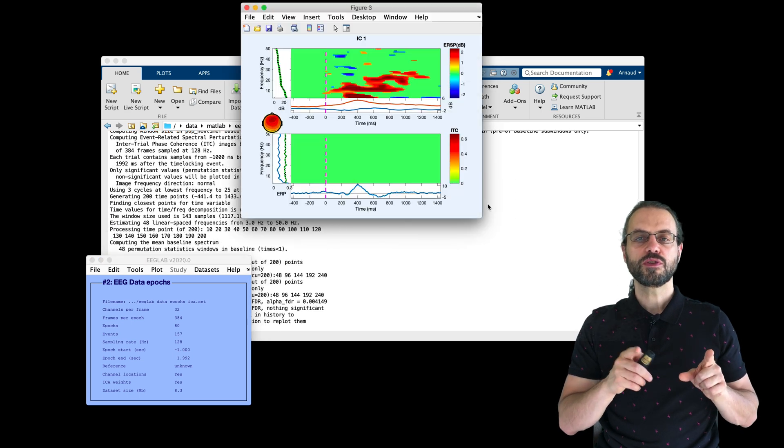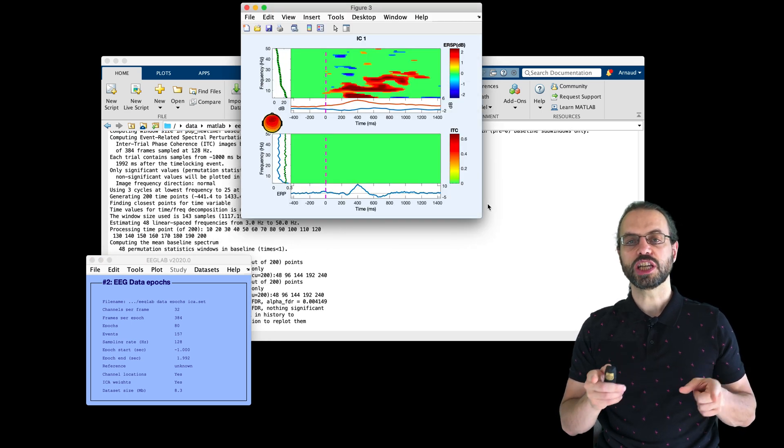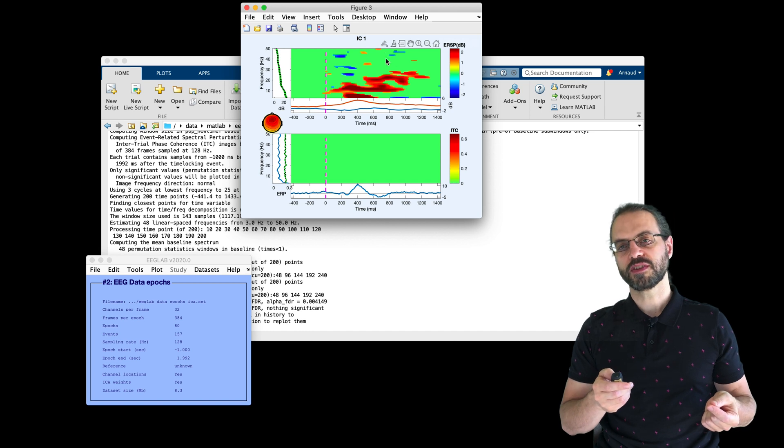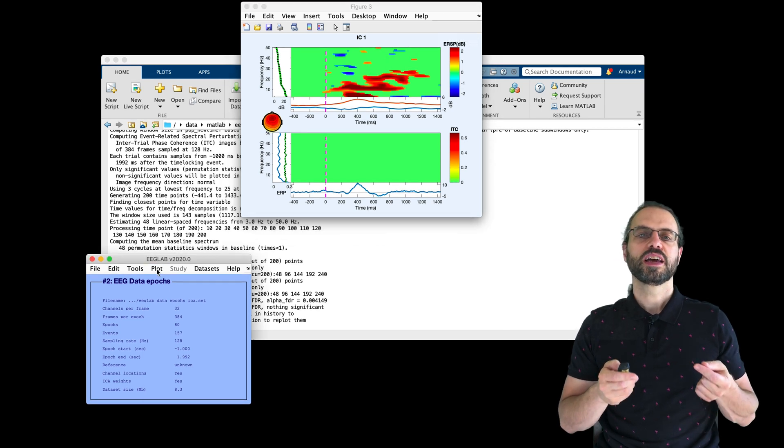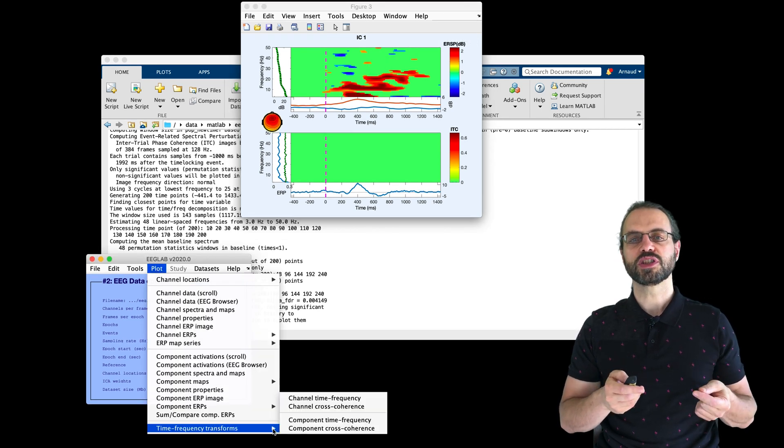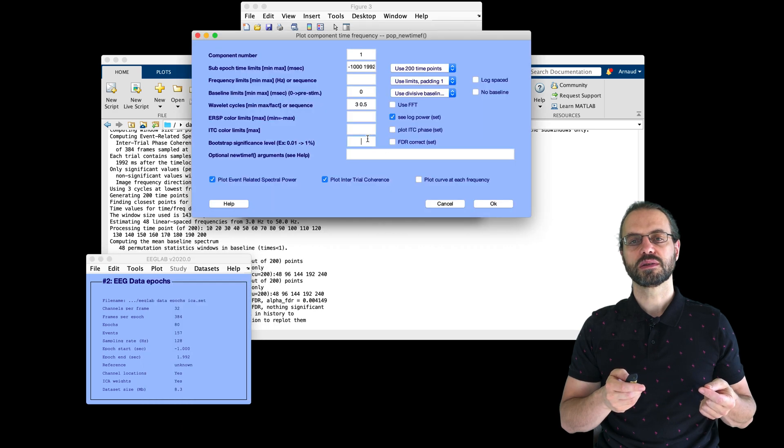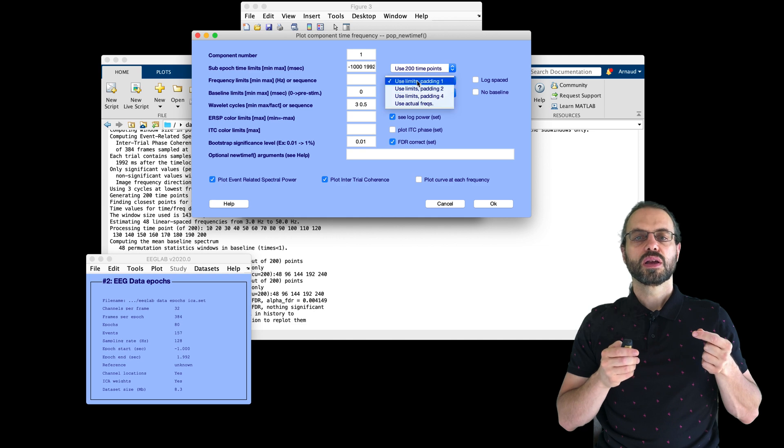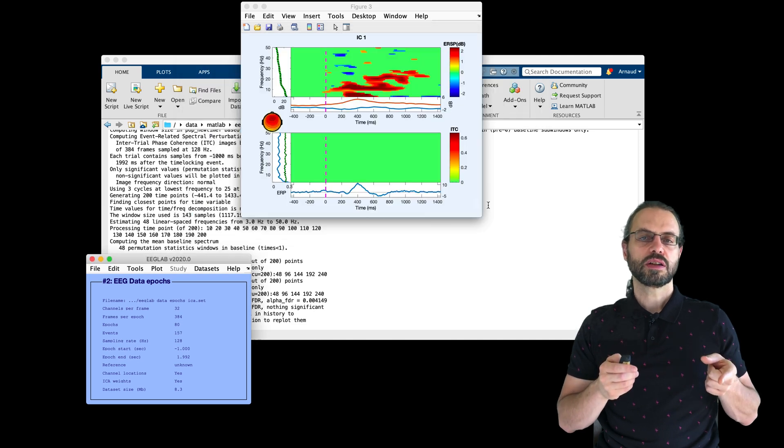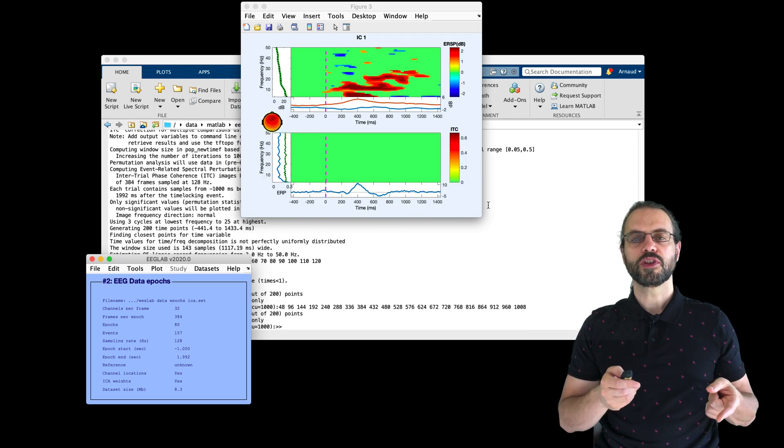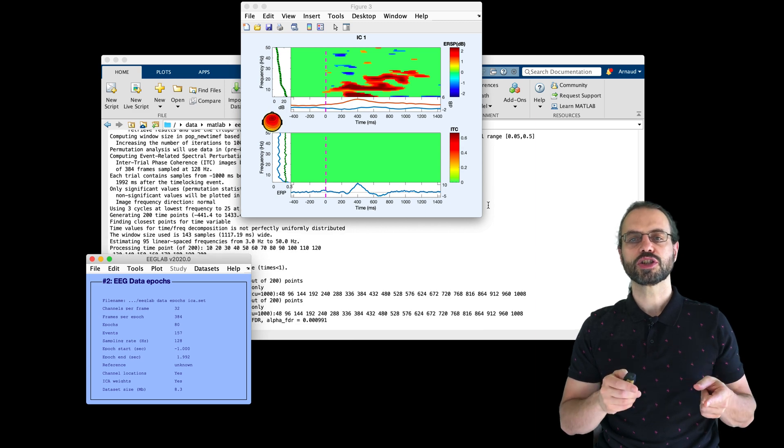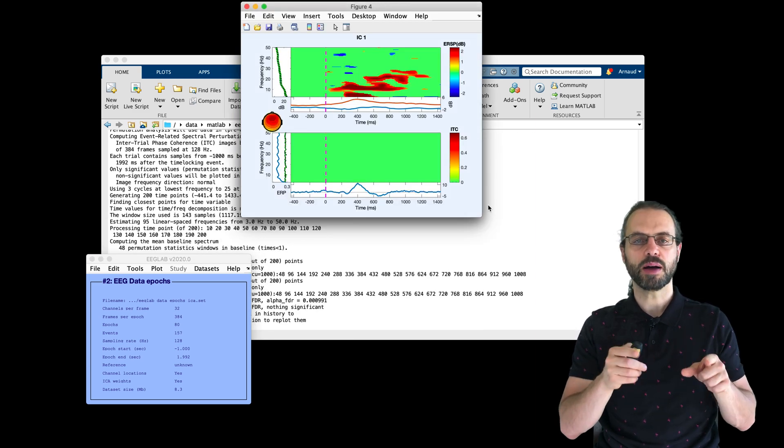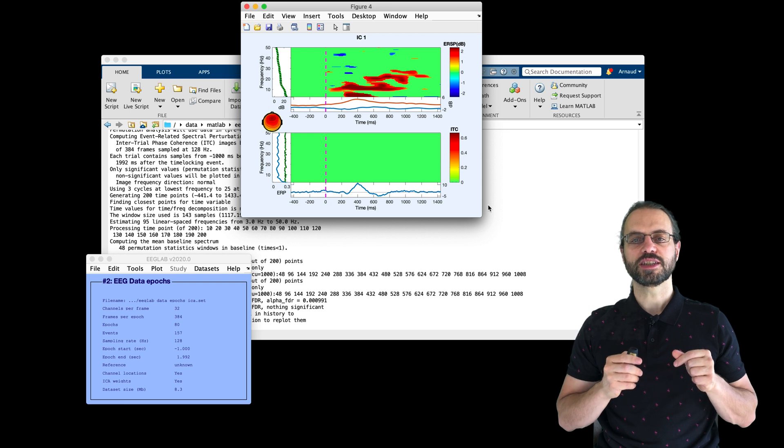Are these few negative pixels real changes? We can increase the threshold for significance to 0.01 and also increase the number of frequencies. So it takes a little longer to compute because of the higher resolution and higher threshold for significance. But you can see that these negative blobs are still present.